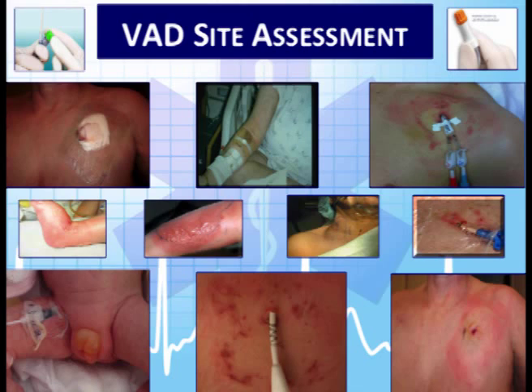I don't think we're doing central line dressing changes in the field, but just to know that a site like that, with that drainage just sitting at the site, is really not acceptable and should probably be changed. We don't want to see the site bruised. That would be concerning to us.